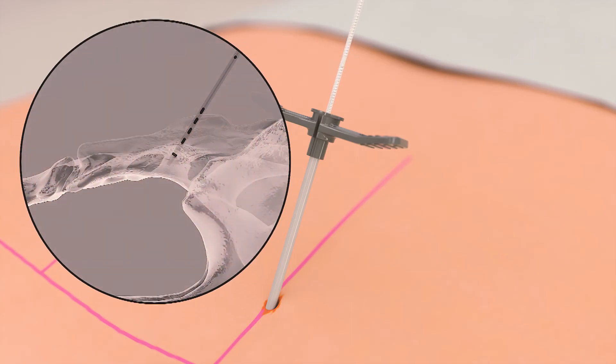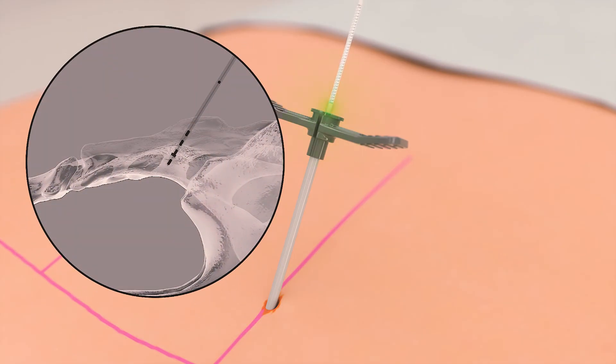The first white mark on the lead indicates that the most distal electrode is at the tip of the introducer sheath. The lead should be advanced until the most proximal electrode, electrode 3, is straddling the anterior aspect of the sacrum, taking care not to advance the lead beyond the second white marker.